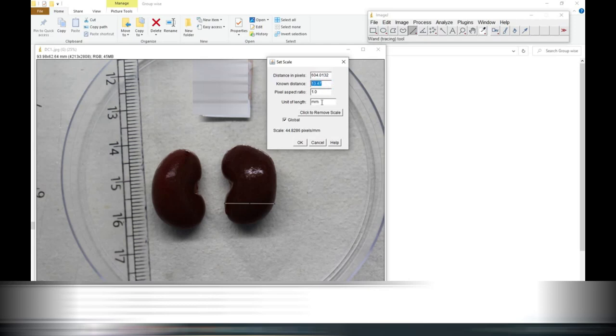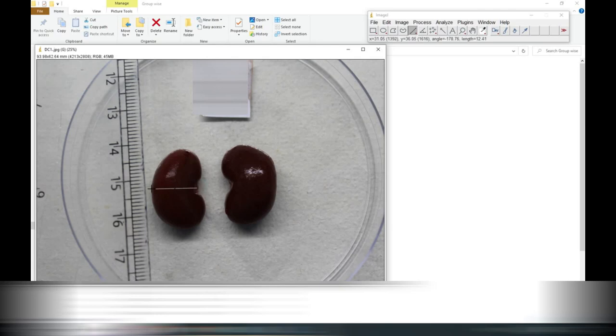Likewise you can do all the measurement for length and width of the kidney by using ImageJ software. Likewise you have to complete this kidney also. How was the video? Comment. Thank you very much for watching.